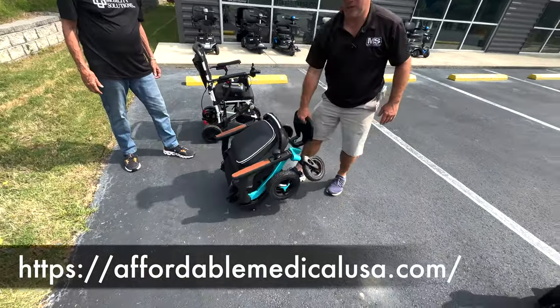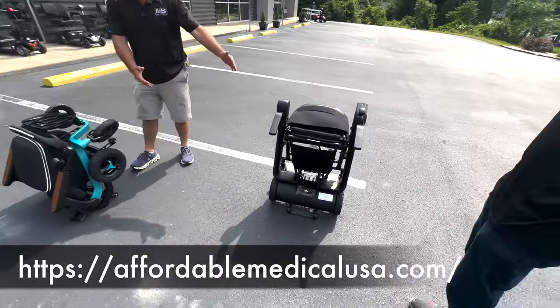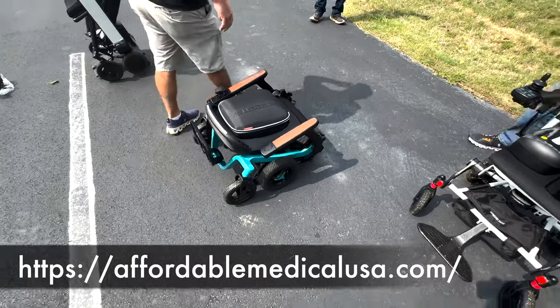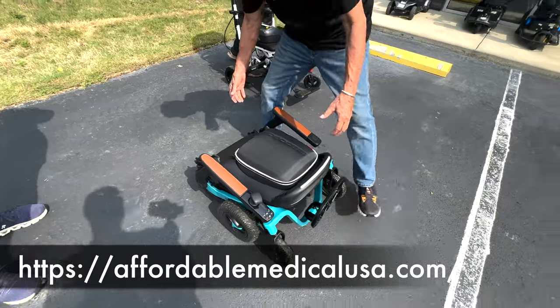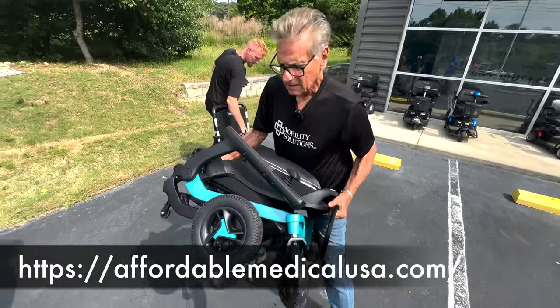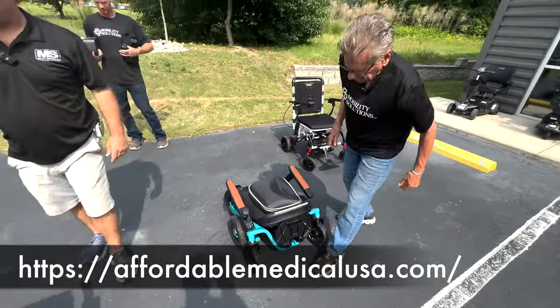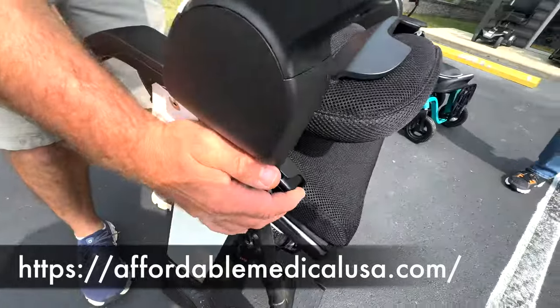From here, just so you know, you can roll it and it stands straight up. So it's just as compact as that one is. All right, Eddie, pick this one up. Just pick it up. Yeah, that's not bad. This is not bad at all. It feels like about 45. 49 without the battery, they say. This is how you unfold this one. Foot on that back plate, and you're gonna push that button.